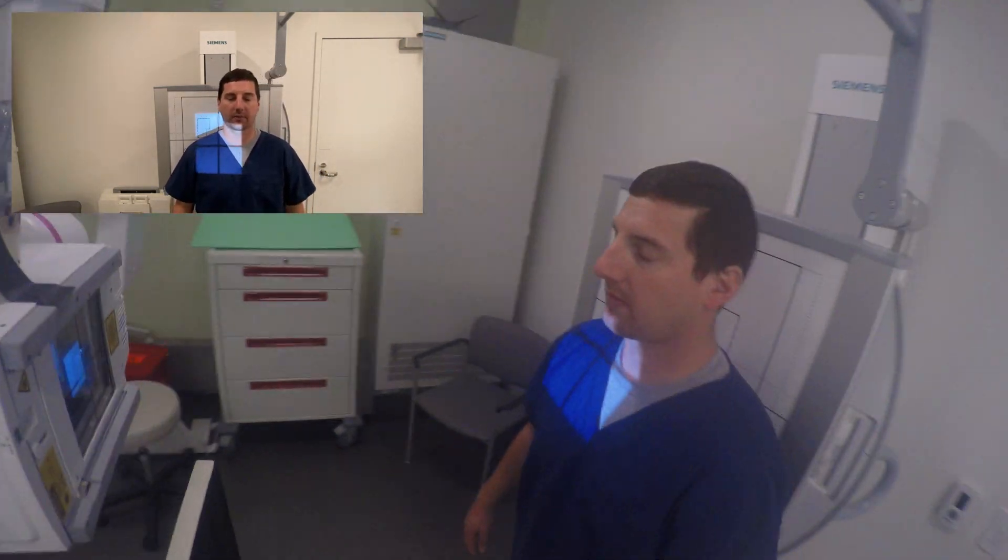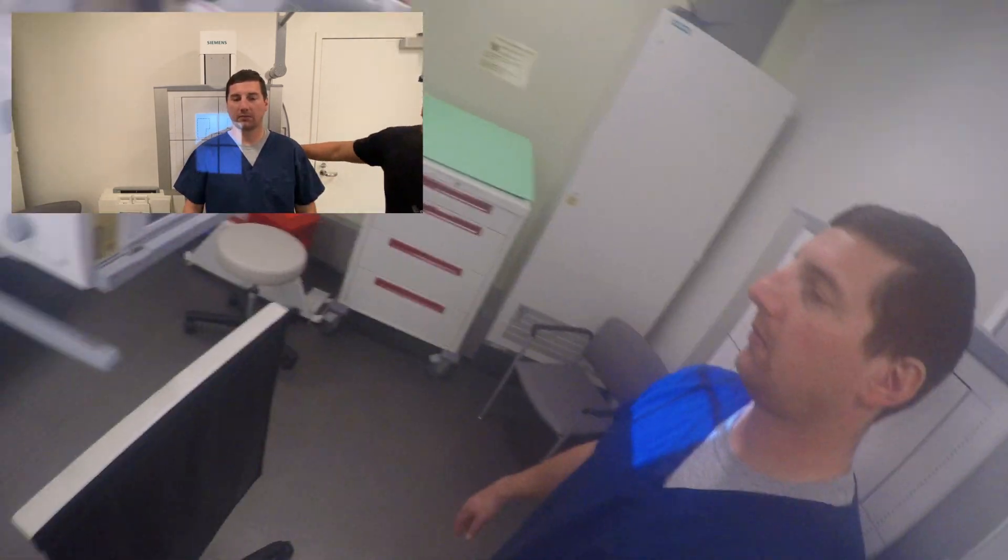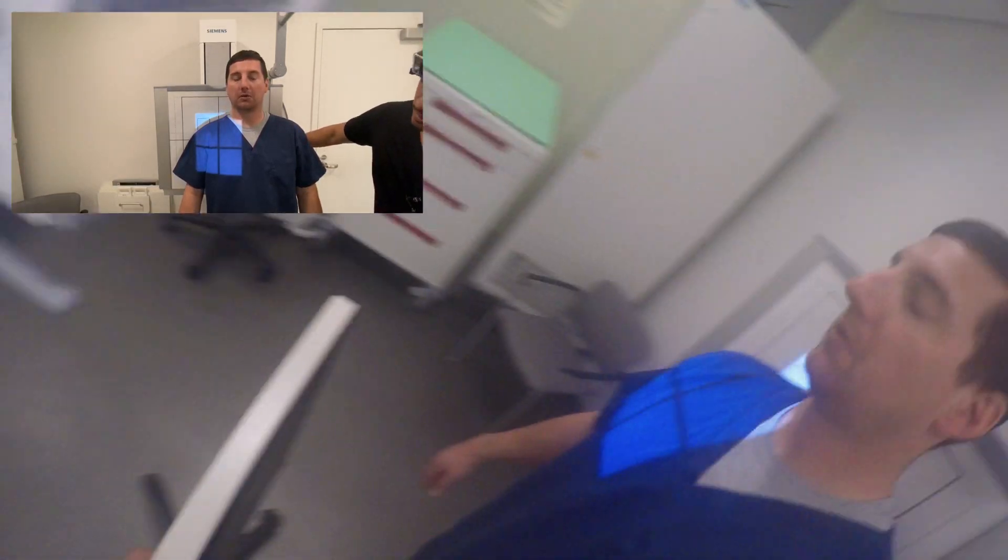About right there. Yeah, good. I'm going to slide you over towards me just a little bit more. There you go. Hold there. We'll get everything lined up to your height. Do you have any questions? No. Okay.